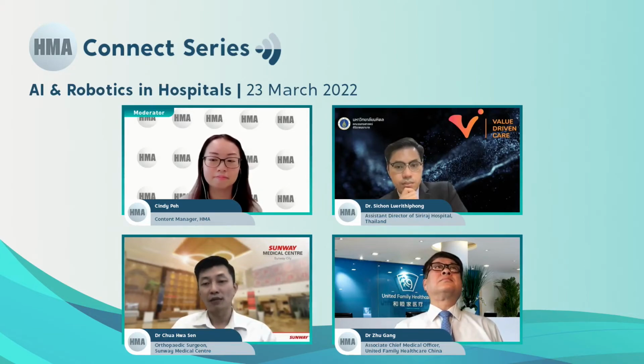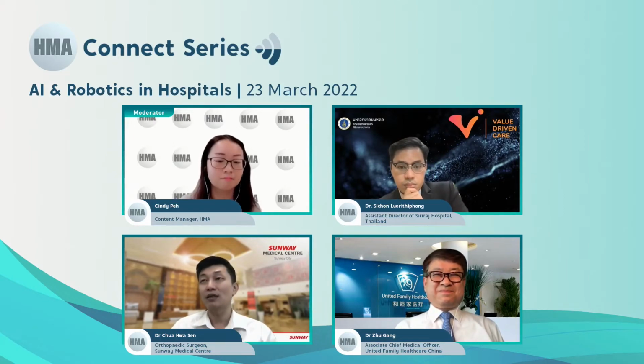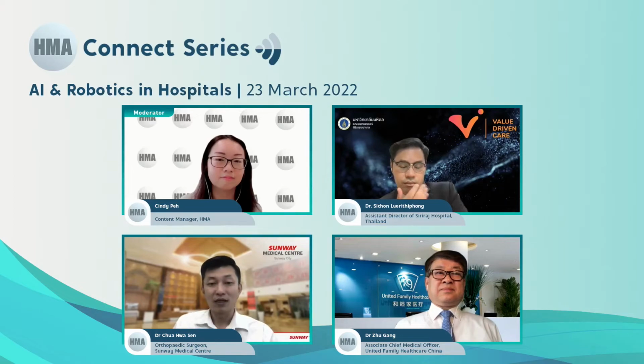Personal wish list onto what the robot can improve: it will be the size of the robot. If you can downsize it, that will be good. The mobility of the robot, if the robot can be moved from one place to another, it will help us in covering a bigger area. What other wish list? If we can control it even more remotely with the help of 5G, 6G, we do not know, in terms of the speed of the networking, that will help a really good surgeon do a very complex surgery from very, very far. So these are all the wish list I have. Last but not least, if there are also checks and counterbalance between the robot and the surgeon, I suppose that will also add a little more value to the robotics per se.